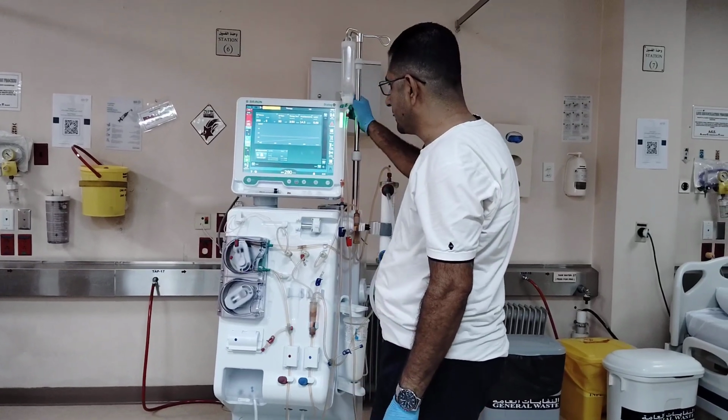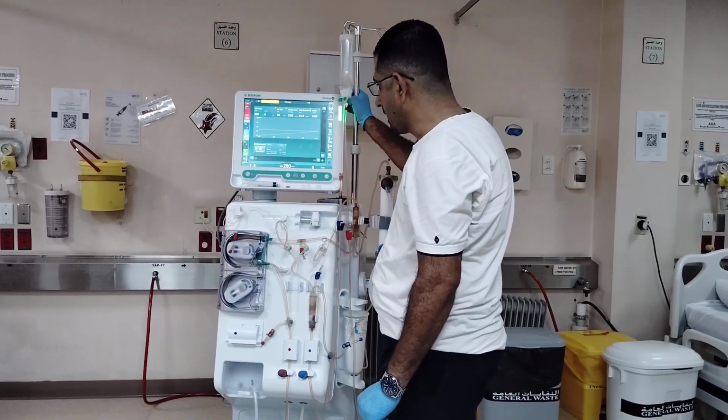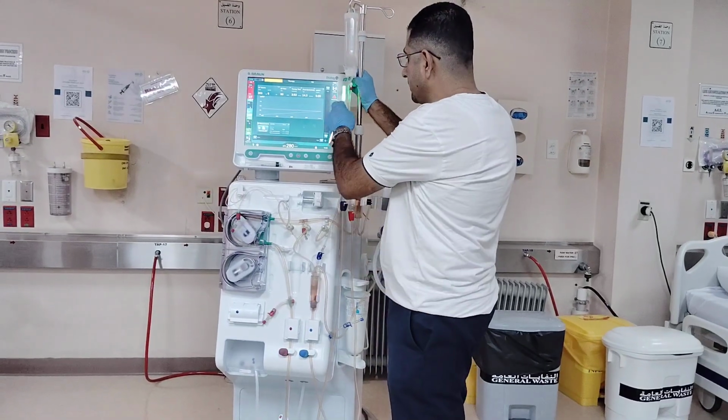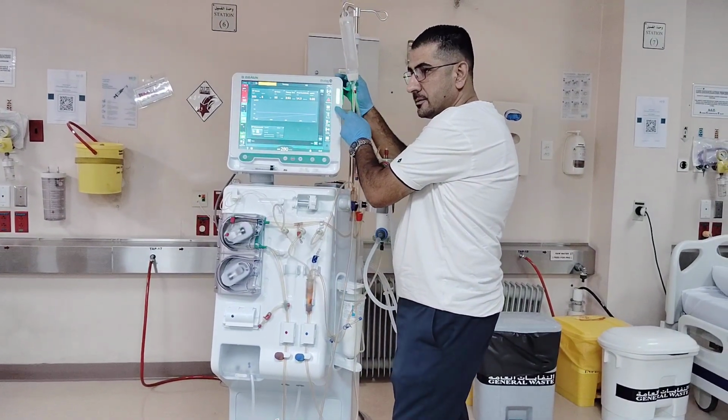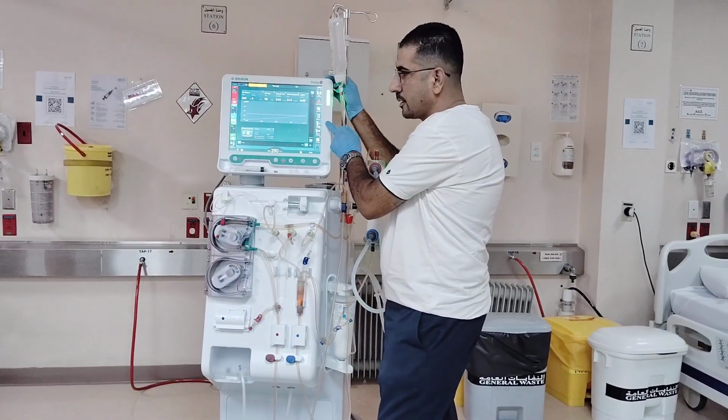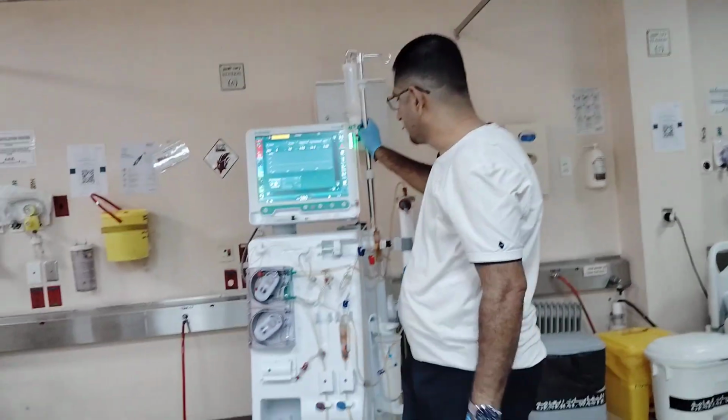Now I will release the vessels. How about minimum UF, sir? Where is that, sir? The minimum UF, here. There, the menu.